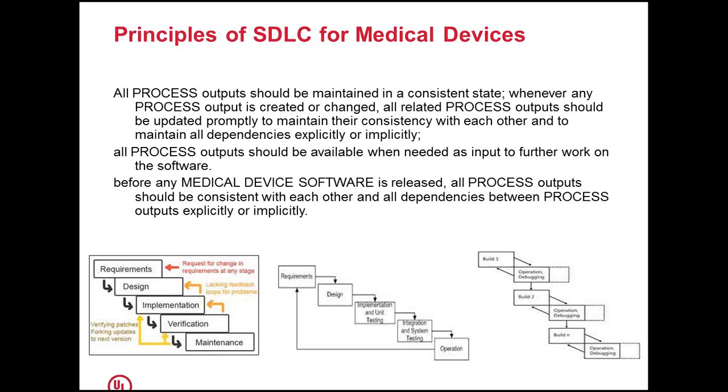What this means is that whatever changes you make, at whatever stage, you need to review them completely, see the overall impact, and take action wherever needed to update. So if it requires you to go back and redefine your requirements from a testing phase, you need to do it. That's in a nutshell what it means.